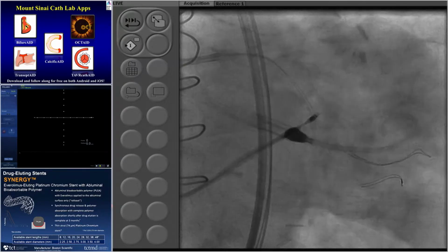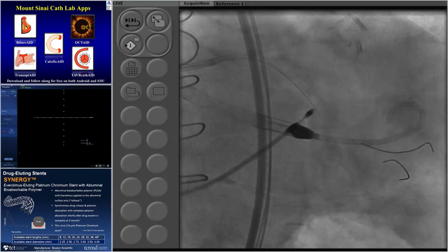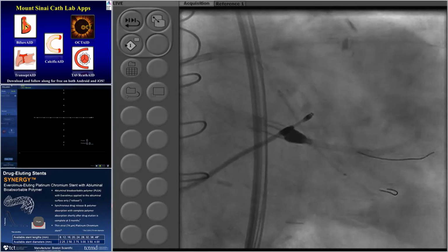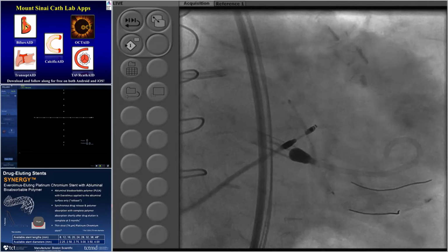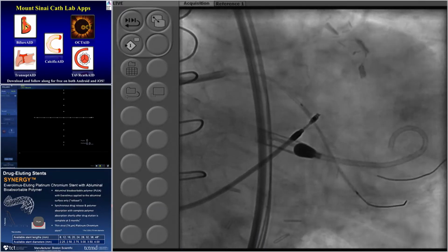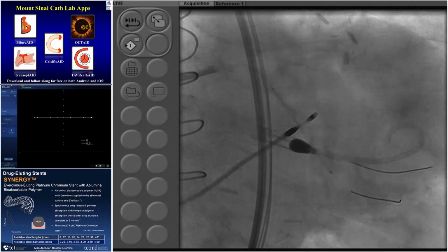Okay, so anyone has any thoughts about stent types in the left main, that one versus the other, or are they all kind of equal and you can just close your eyes and pick one? Well, without any data, what I say is that now with the Onyx 4.5 and 5.0, there is a trend towards using more Onyx than other devices, but I think that all the other stents should equally perform well. And you have those sizes in Synergy now, too. Yeah, so I don't think there is any difference.